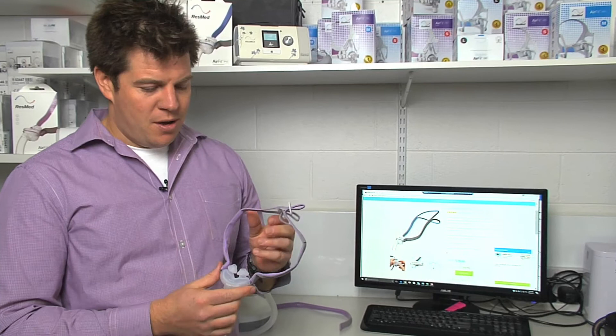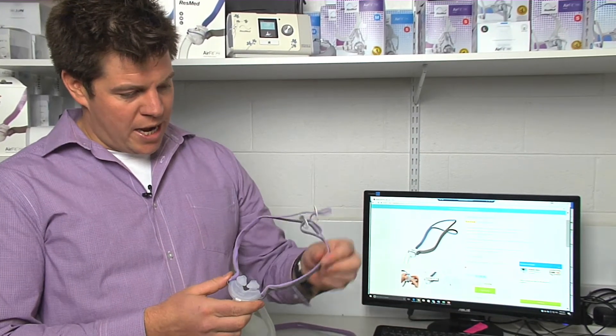So there you have it — putting the P10 back together is nice and simple. Freshening up your mask with a new headgear strap and a new pillow will make a big difference in your therapy.